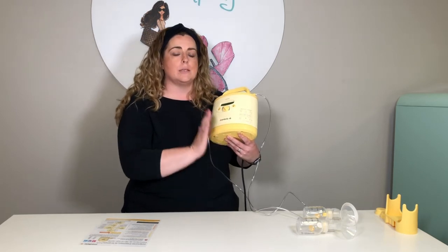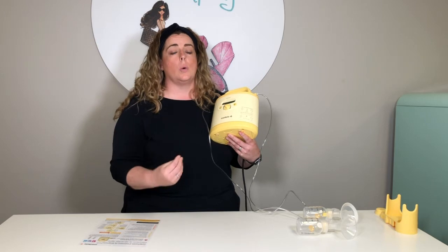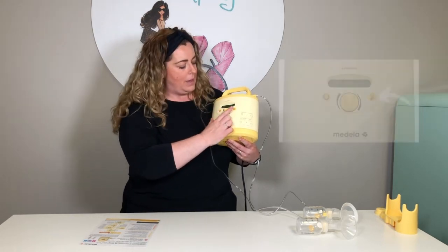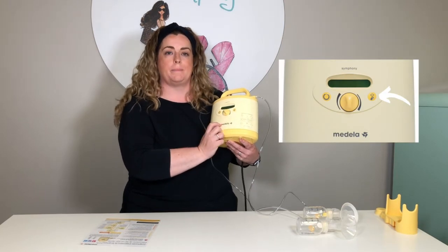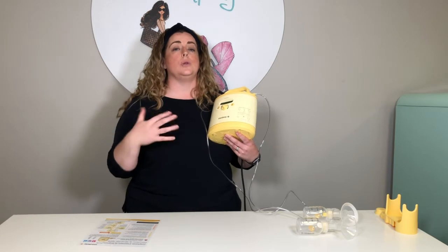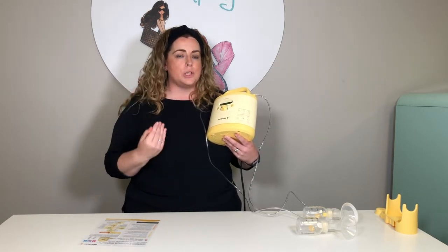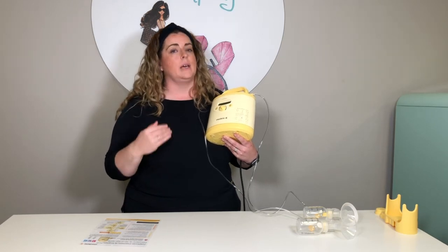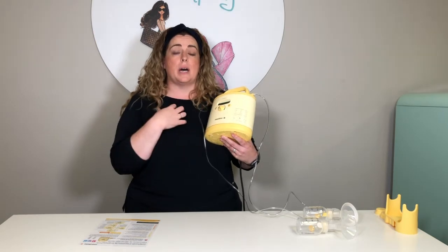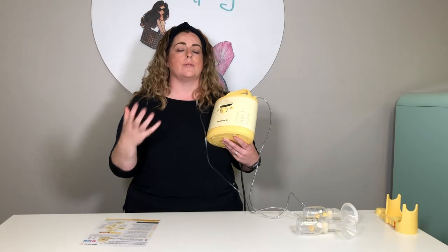So if you're a brand new mom and your milk supply is still very, very low, under 20 mils, you're going to press this button, and then very quickly you're going to press this button. That is going to tell this pump that you need to initiate your supply. You need to start your supply. The reason that you want to use this button is because your body needs to be able to initiate your supply before you can pump larger volumes.